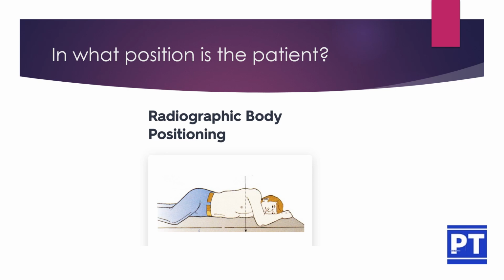Then identify which position this patient is in. The patient is in recumbent position, and the patient's anterior aspect is in contact with the image receptor.